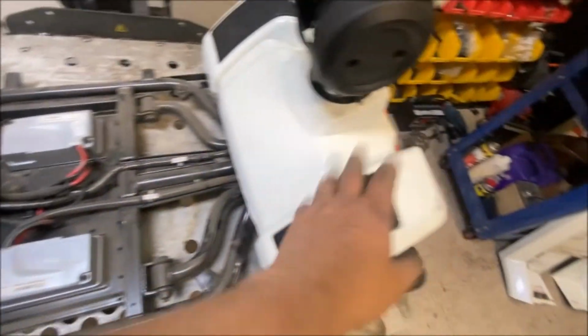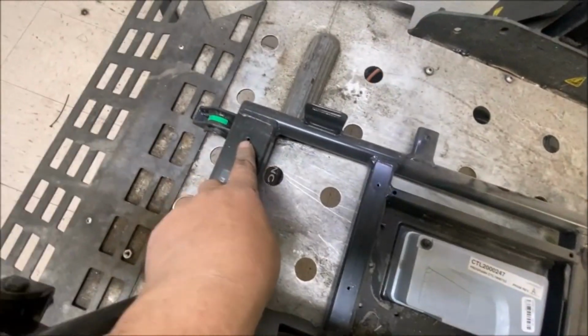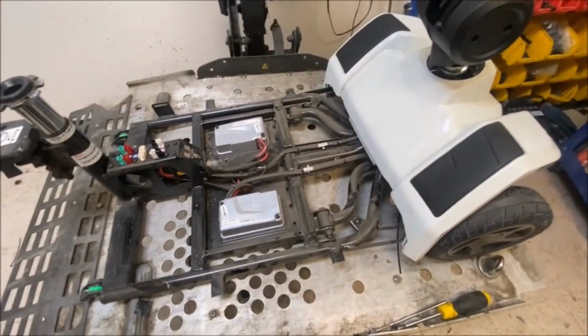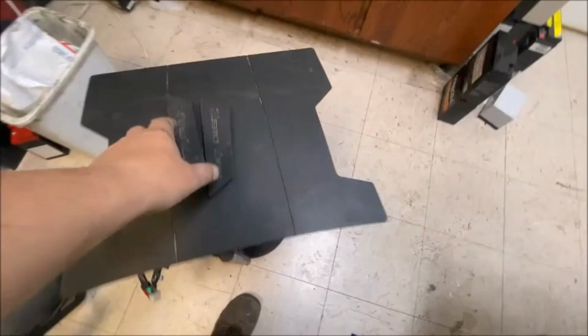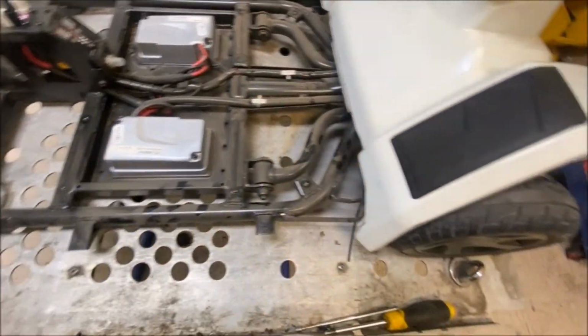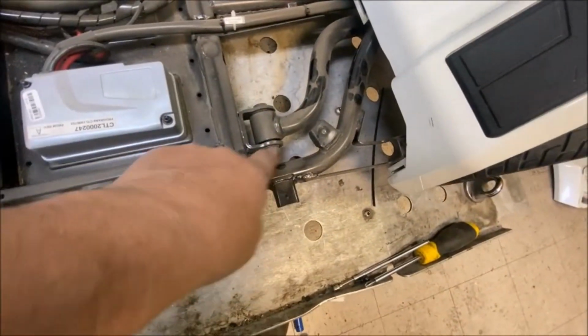Okay, so the shroud's off, the rubber mat's off. You have to take those off to get to the screws that are holding this down. There's 4 on this one, 2 at the back, 2 at the front that hold this down, so you can release that. And this is held down by 1, 2, 3, 4, 5, 6, 7, 8, 9, 10 screws. Easy to remember: ZT10, 10 screws hold the base. Like I said, you have to remove these. Just be careful you don't break these little rubber things off, otherwise you have to glue your carpet down or your rubber mat.